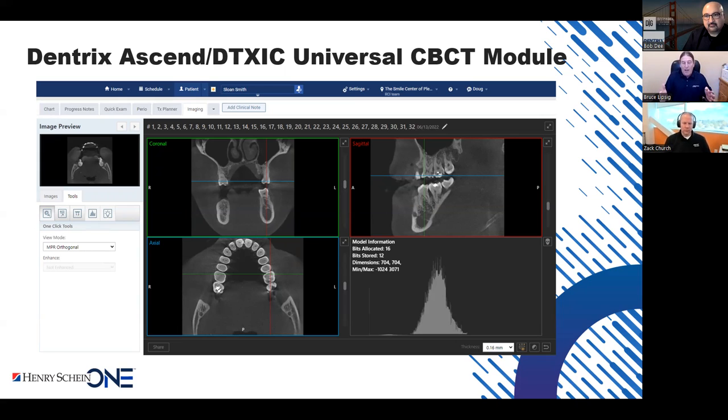You get to that point where now I can do three-dimensional imaging at a realistic cost, and it brings up the standard of care in the office. It helps you to see spiral root fractures and things that you would not normally see from two-dimensional imaging. So as the hardware grew up, our general practitioners adopted it more and more, but that doesn't mean they'd all become oral surgeons and start placing implants. What it means is they're doing better dentistry by seeing three-dimensional images, which give them more data than two-dimensional images, and they're using that to diagnose and treatment plan, right?